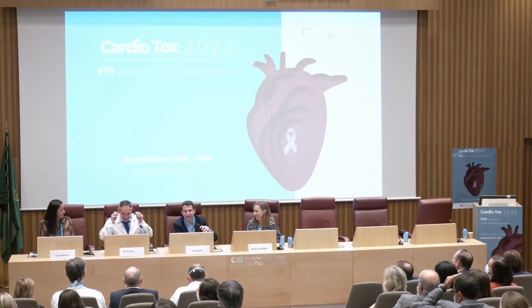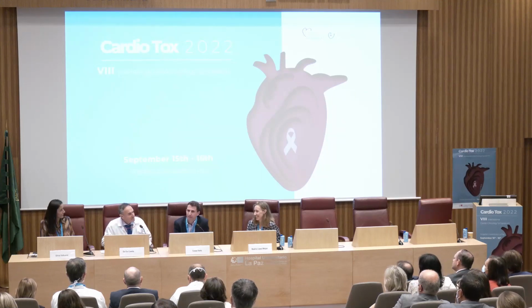At least in my opinion, it may be feasible because it's a 10-minute exam, and you can schedule patients. It's frequent that an oncologic patient has, of course, a CT scan in all the visits, but sometimes they also have, for example, the breast cancer patient has an MR of the brain, and that would be probably 7 minutes or so longer inside the magnet if you want to add a MyoStrain in those patients. And if they don't have an MR scheduled for another reason, a 10-minute MR is probably feasible. So it's just to organize yourself and to try to be very efficient. And I at least consider it could be feasible in the routine clinical workflow.